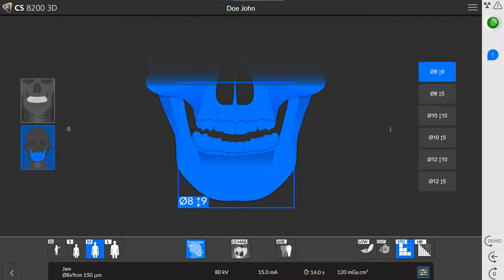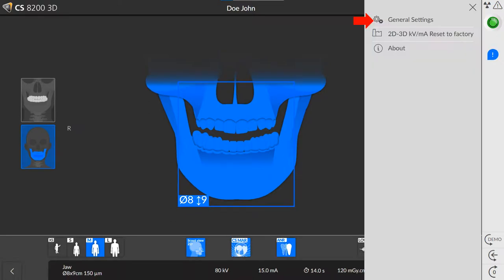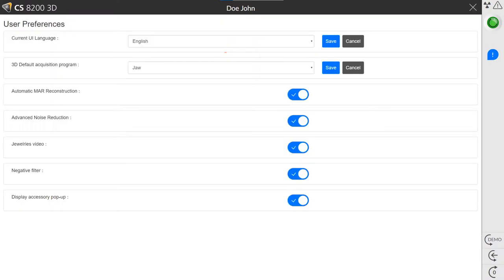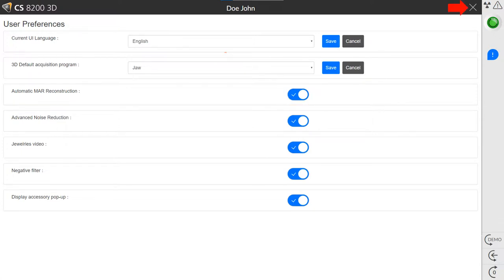If you want to set MAR and ANR to be activated automatically, click the Menu button and then click General Settings. The User Preferences window is displayed. Click the toggle button to enable MAR and ANR, or click the toggle button again to disable them. Click the X to close the User Preferences window.